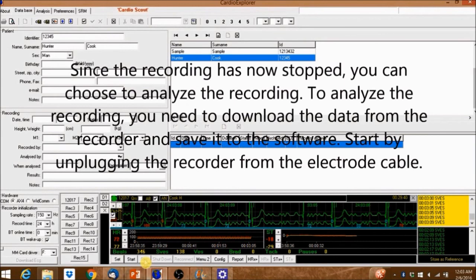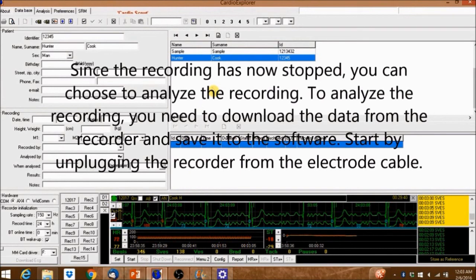Since the recording is now stopped you can choose to analyze the recording. To analyze the recording you need to download the data from the recorder and save it to the software. Unplug the recorder.